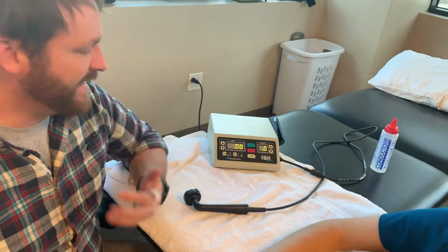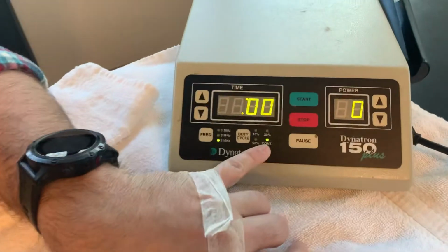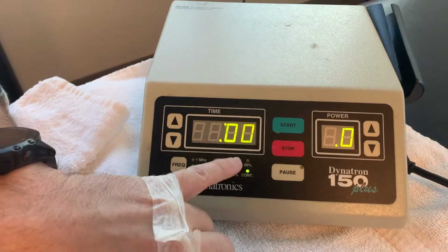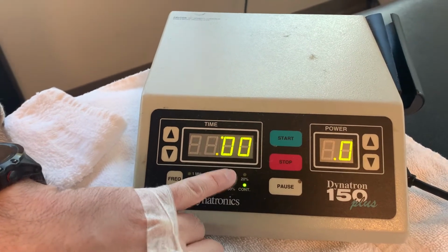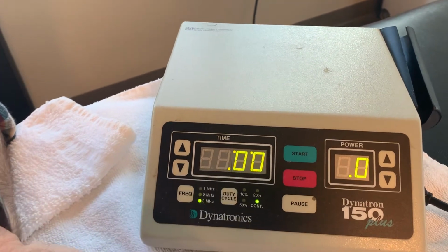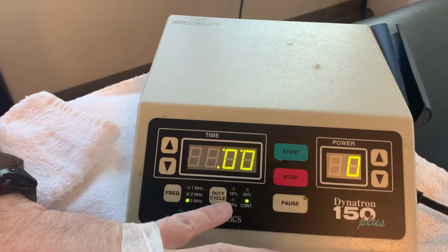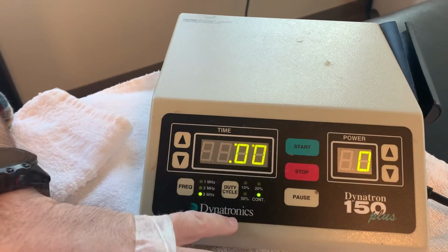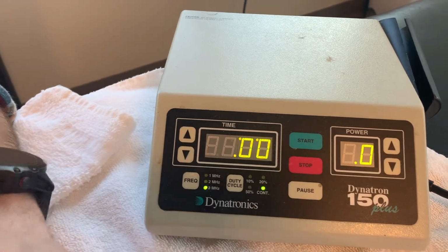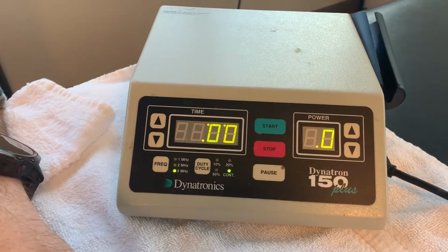If we're trying to heat up the tissue, if we're going for the thermal effects of ultrasound, we're going to use a continuous setting. Most of the research has been done on a continuous setting or a 20% setting. So when we're talking about non-thermal, I'm going to typically use the 20% because that's been the most researched. Now we should get some of the same effects or a hybrid effect of heat and non-thermal if we went to 50, but again, that hasn't been shown to be the case in research. It's just an extra setting that they can use as a selling point.